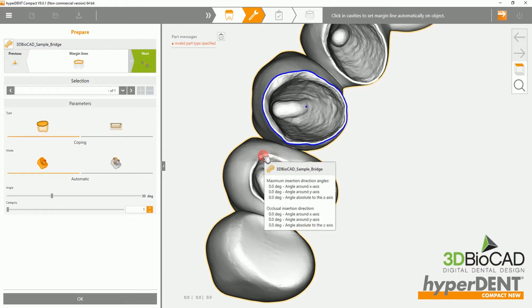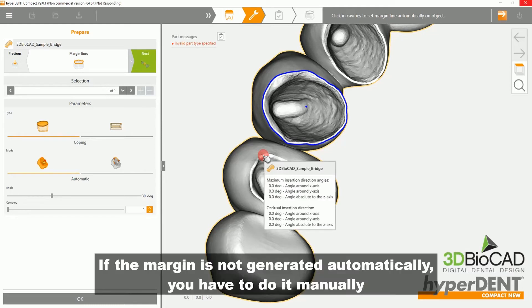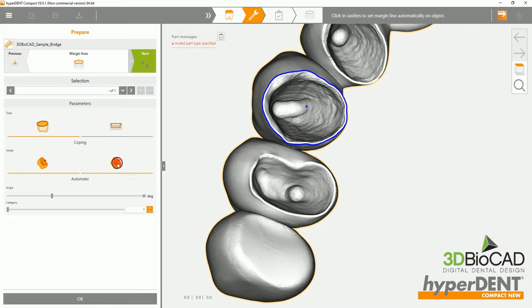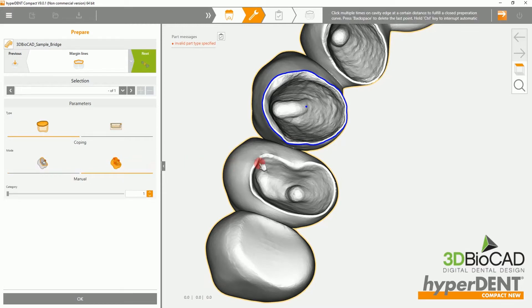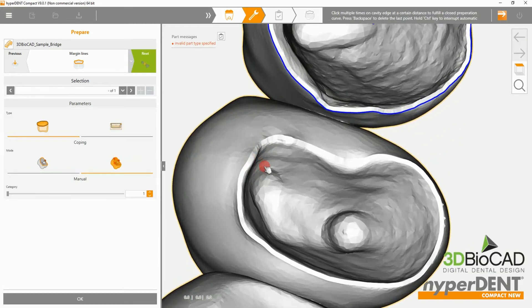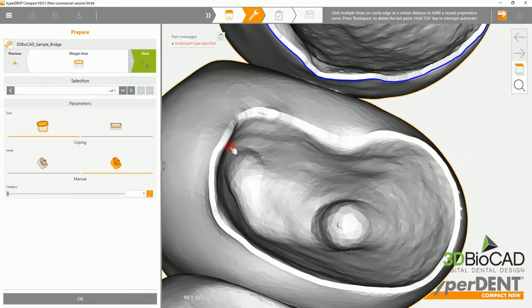If the margin line is not generated automatically, then you will have to do it manually. To do this, please select the manual option on the left side of the screen.